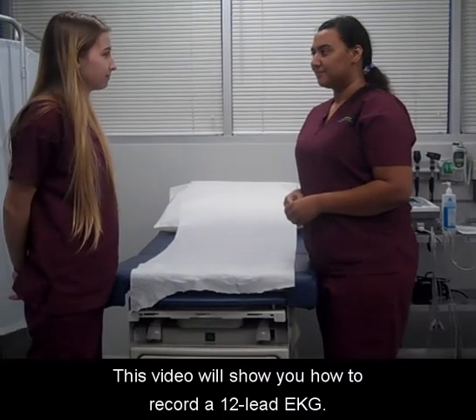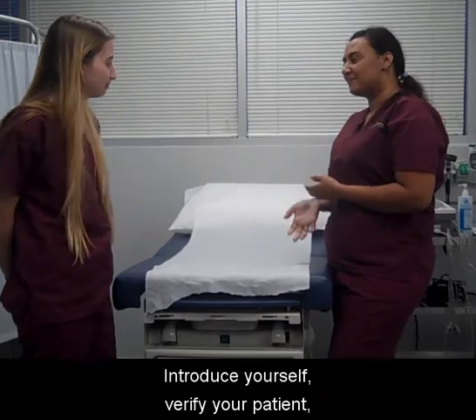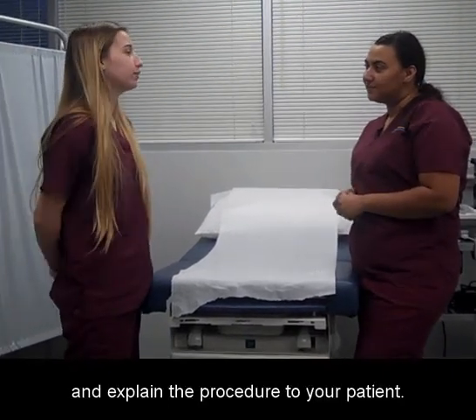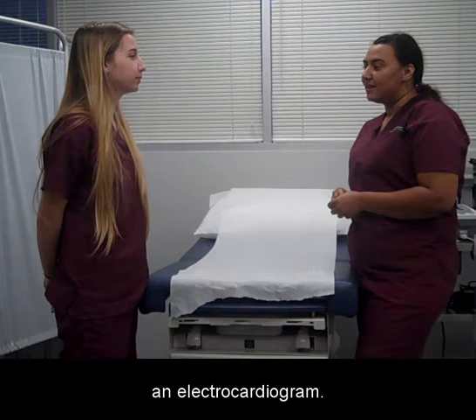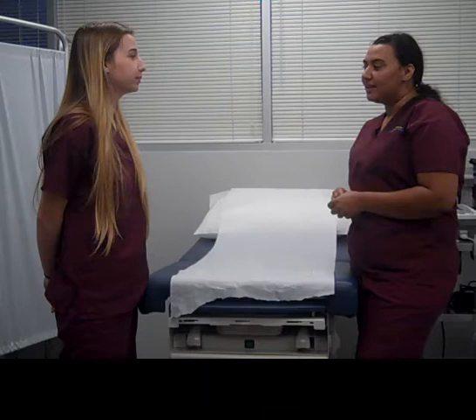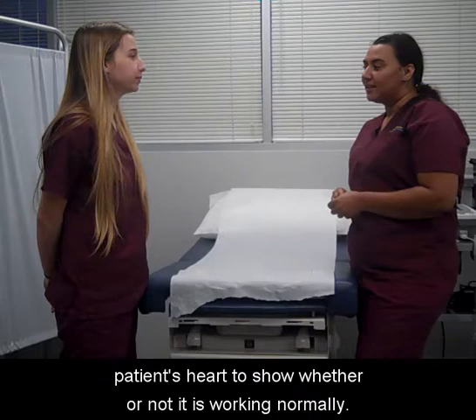This video will show you how to record a 12-lead EKG. Introduce yourself, verify your patient, and explain the procedure to your patient. A 12-lead EKG is also known as a 12-lead ECG and also an electrocardiogram. This test will gather information from 12 different areas of the heart. This test will measure the electrical activity of your patient's heart to show whether or not it is working normally.